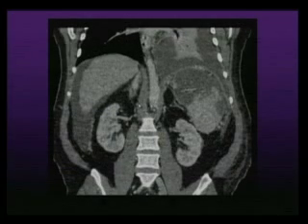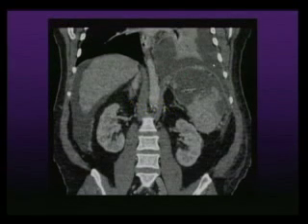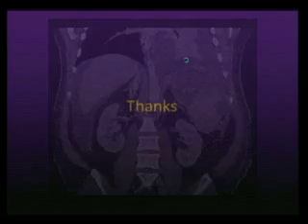So we actually did a splenic embo. This was the one I showed you initially, that he had complication of pleural effusion, atelectasis. This was drained, and he did okay. But always realize this is something which can happen. So when you embolize the upper pole, you might be treating the varices, but you will have these complications. So tell them to look out for pneumonias, incentive spirometry, and so on. Any questions?